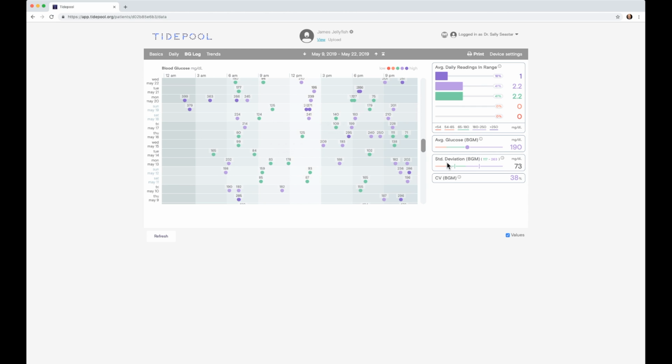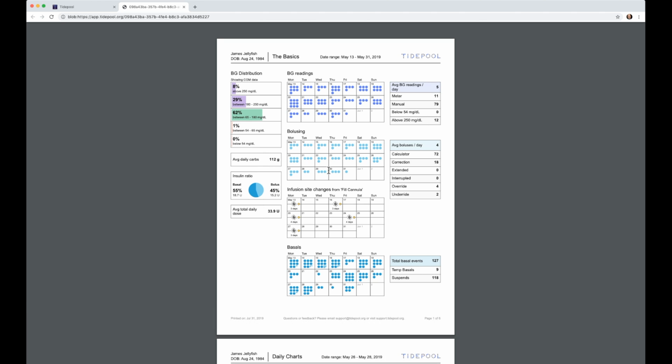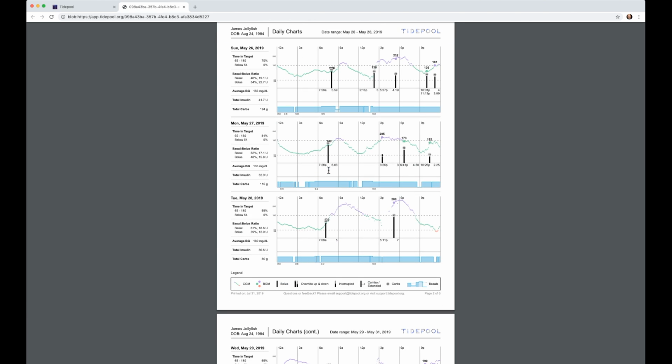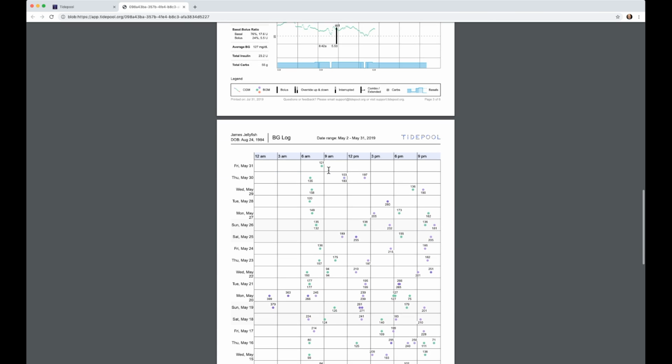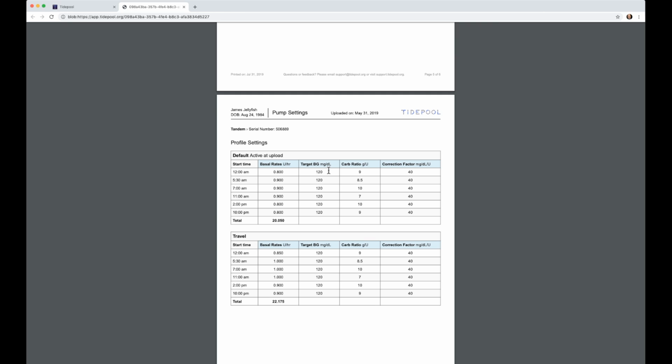While we have 2 weeks of data within the blood glucose log section, if you're looking for more data to come out of this view in particular, you can click this print button, and the Tidepool web application will generate a PDF that includes everything that we've seen from the basics view, the last 6 days from the daily view, the last 30 days from the blood glucose log section, and the insulin pump profile settings at the last time of upload. This is one way we currently offer to get Tidepool data offline. This can be printed out and held in your hands if you want to get analog with it, or you can save this and upload it to your patient's electronic health record for future reference.